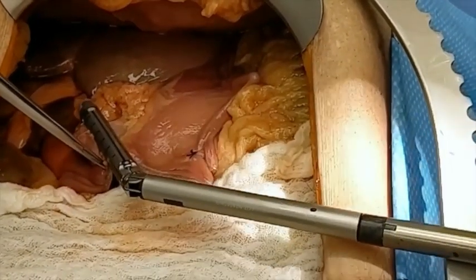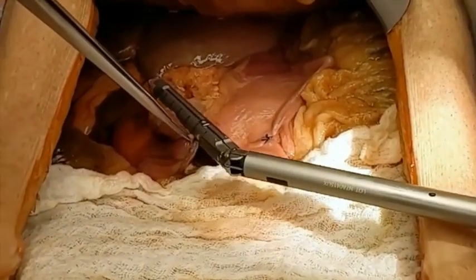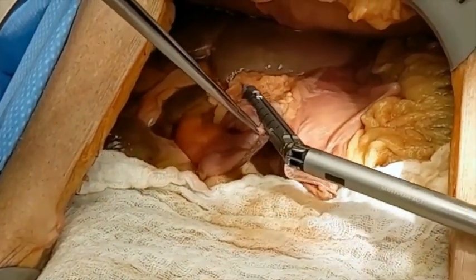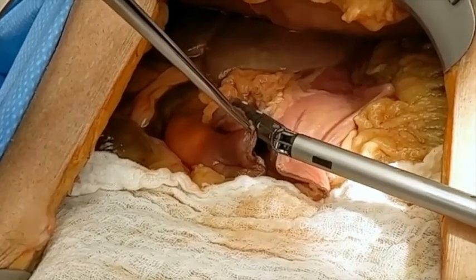The lesser omentum is also mobilized off the lesser curve of the stomach, ensuring that the right gastric artery is identified and ligated, and a linear stapler with an appropriate bowel load is used to transect the stomach.